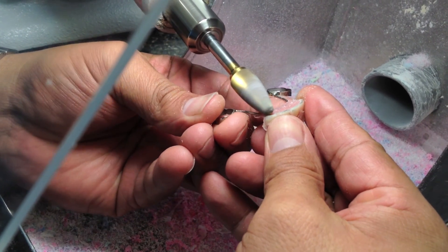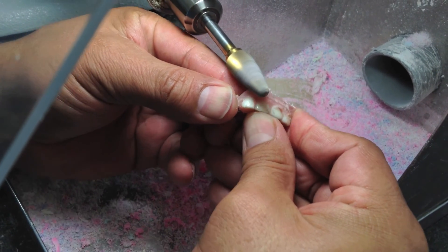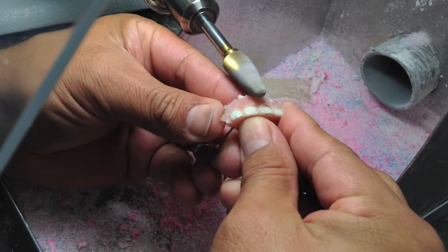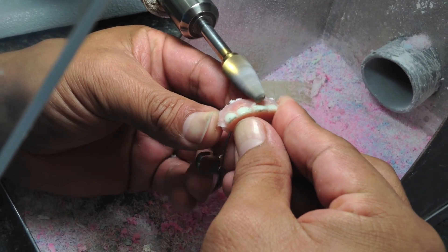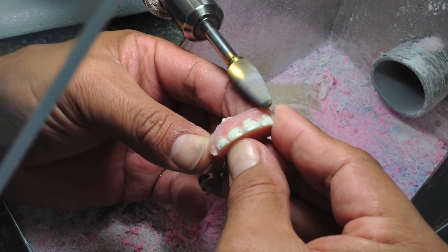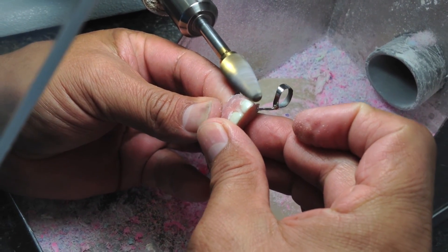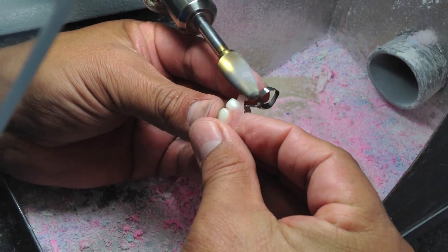The next few videos are just going to show him using successively smaller and smaller burrs, starting with this lathe burr and ending with a little tiny round burr, just whittling down the flanges to where we think will be comfortable, but still have enough acrylic to look natural and to support the teeth.